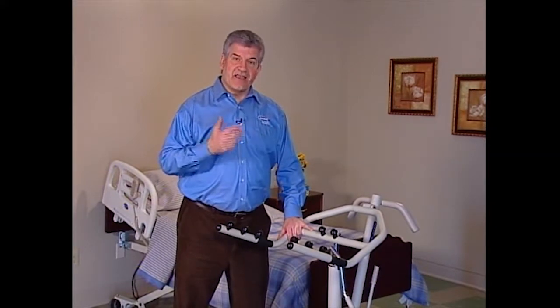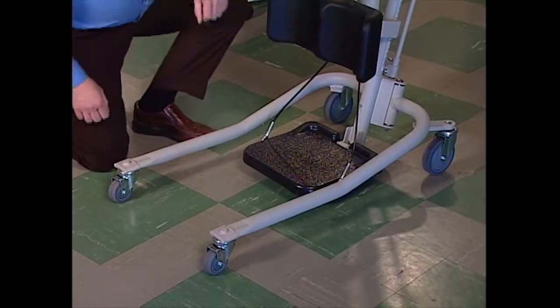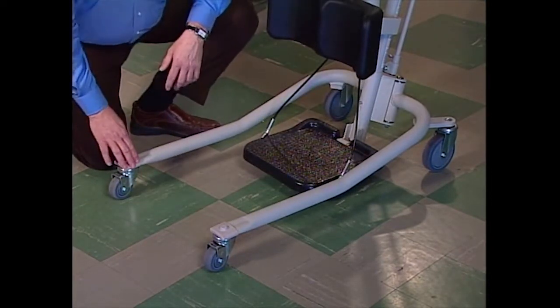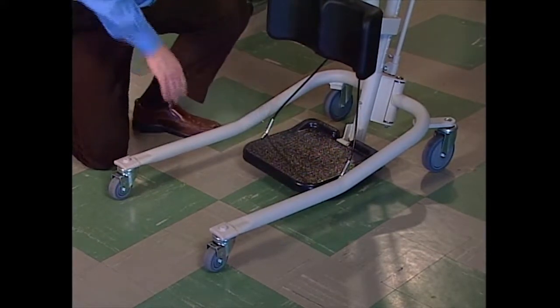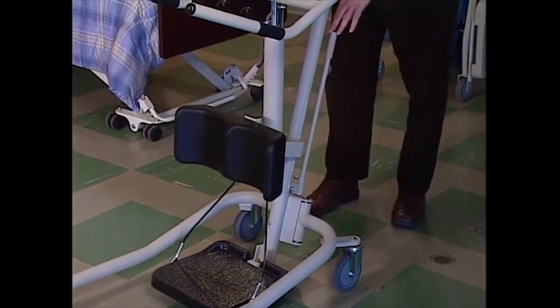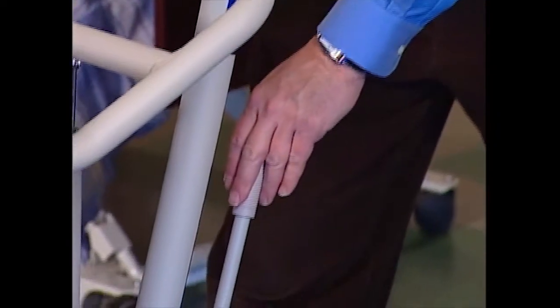The base rides on four low-friction casters for easy maneuverability. It has a flip plate and two easily adjustable and locking legs. They can be opened and closed by using the padded shifter handle. To open the legs, grab the steering handle with one hand and the shifter handle with the other.